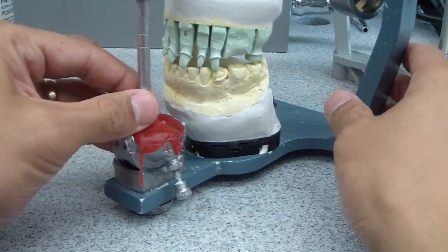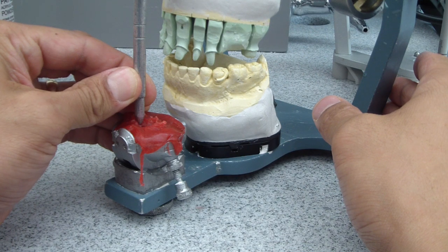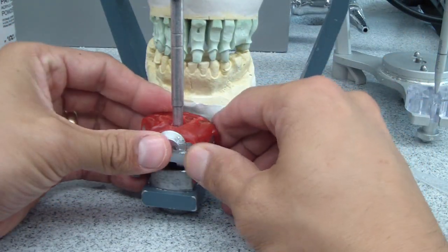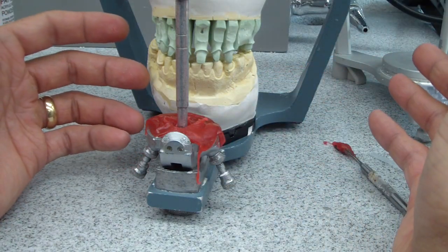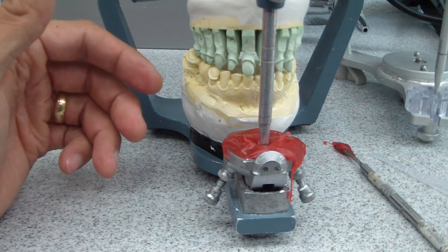There's my protrusion and my left excursive pattern. So that's really the reason why we use a custom incisor guide table. I'll clean this up and then off we go getting our restorations fabricated. I'm excited. Cheers.